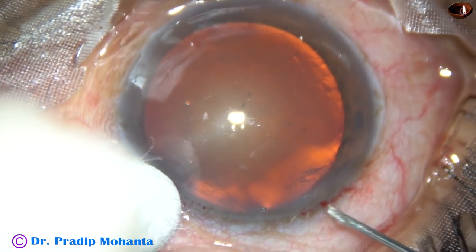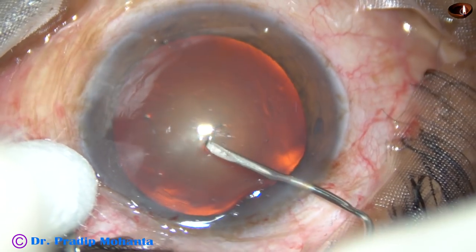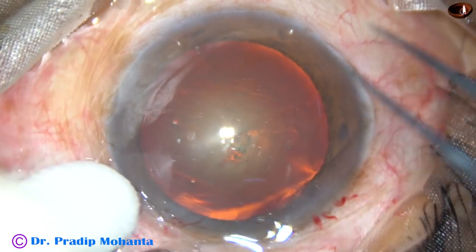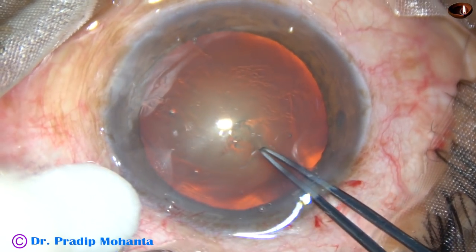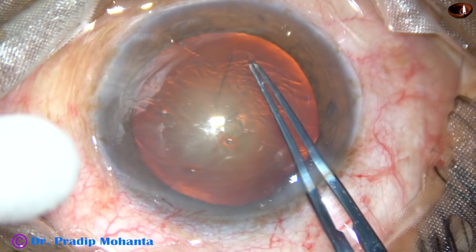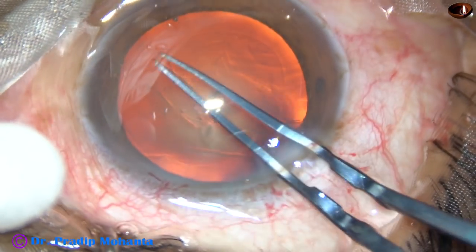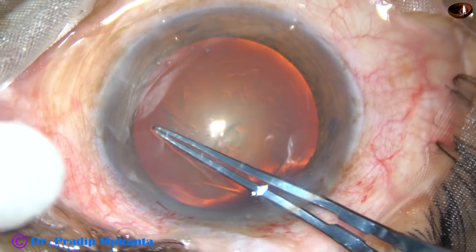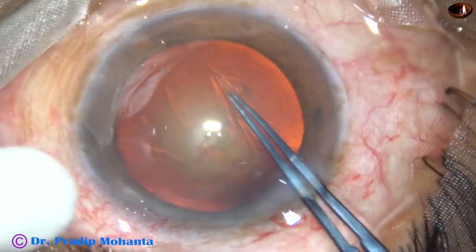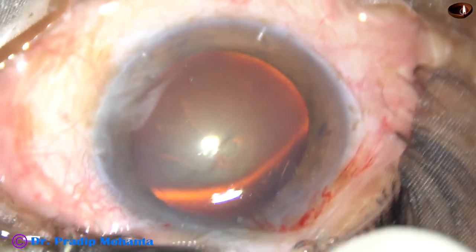Now, capsulorhexis. I incise the capsule with a 26-gauge bent needle and raise a nice, very easy-to-hold capsular tag. I take the forceps, hold this capsular tag, go clockwise all around, remaining at a certain equal distance from the margin of the dilated pupil. And thus I manage to get an optimum-sized round rhexis. The margin of the pupil is the guide.